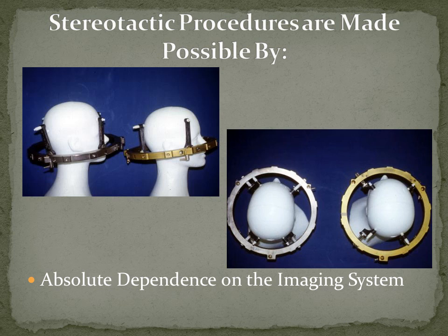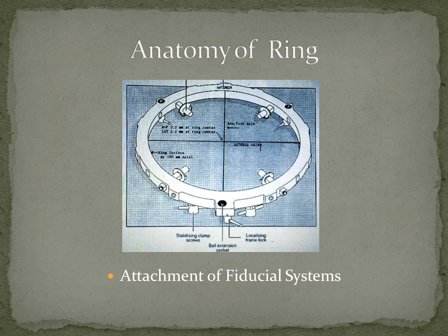There are other things that we'll talk about in ring application, but what really matters is that things don't move. The ring itself is the one we use, which is based on the BRW system, has a coordinate system where the center of the ring laterally and anterior posterior is 0, 0, 0 in the middle, and the ring surface is at an axial coordinate of -80.